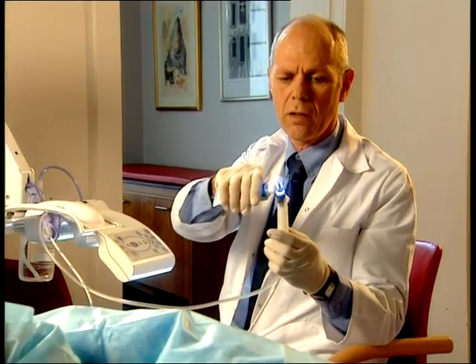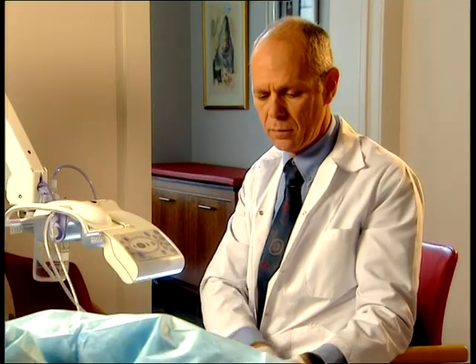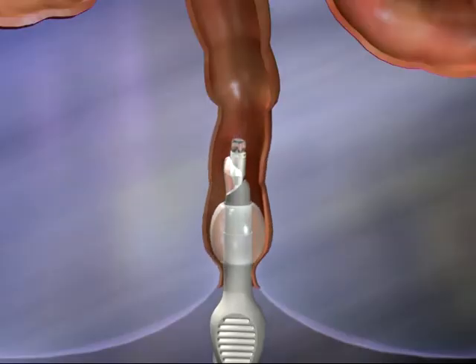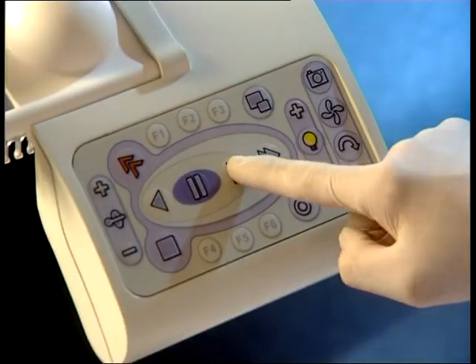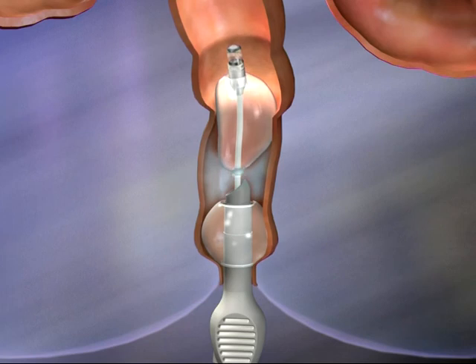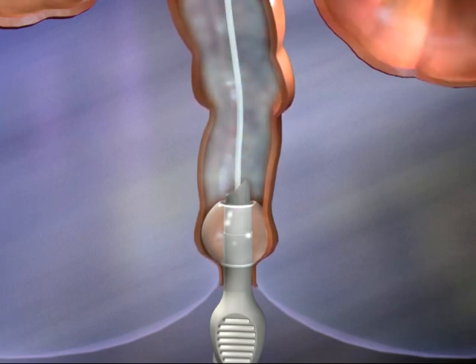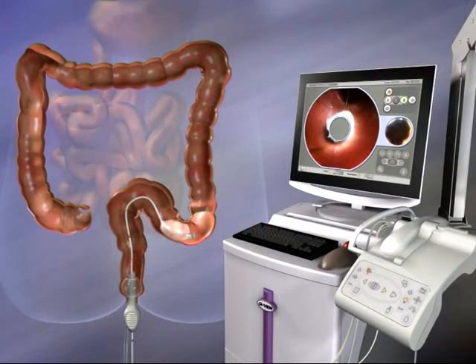To begin the examination, the rectal introducer is inserted and the rectal balloon is inflated to anchor the device and seal the anus. The scanner balloon is then inflated. CO2 is delivered through the gap between the rectal introducer and the supply cable, and fills the space between the two balloons.